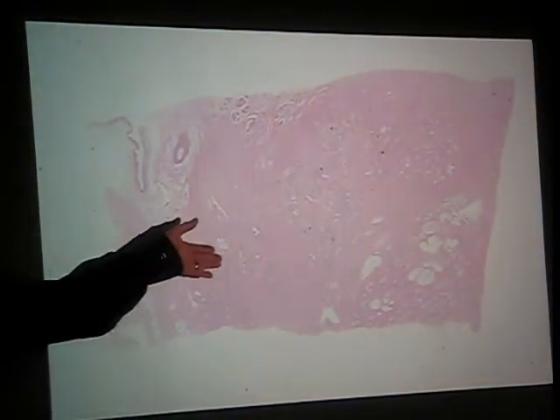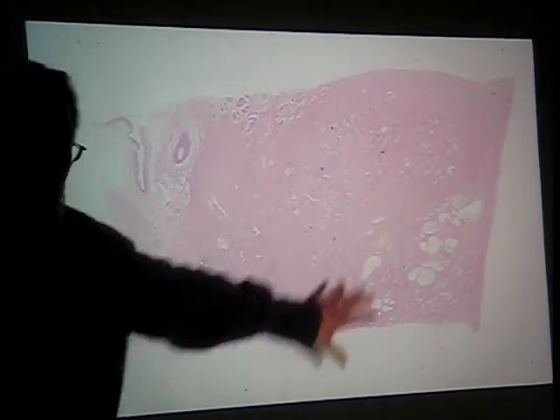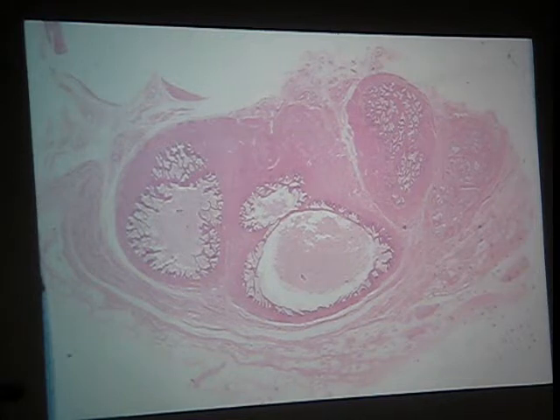Okay. In contrast to prostate, you've got lots of tiny little lumina here, but they're in a parenchyma that's fibromuscular, right? So a fibromuscular stroma. I mean, if you look at that, and look at that, and I expect each of you to pull your slides out, lay them on a light background, and make sure you can make that distinction.